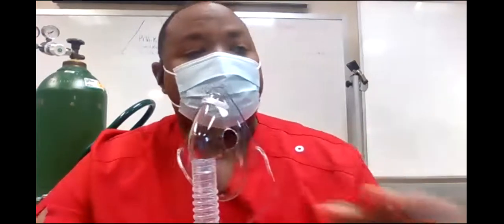So think about all of your stuff that we've shown today. He's on nasal cannula, how much? 2 liters. Switch him to a nasal cannula at 2 liters, because that's going to give him about what percent? 28%. So I put him on a nasal cannula at 28% and let him eat. Now he can eat, he can talk without losing his oxygen.